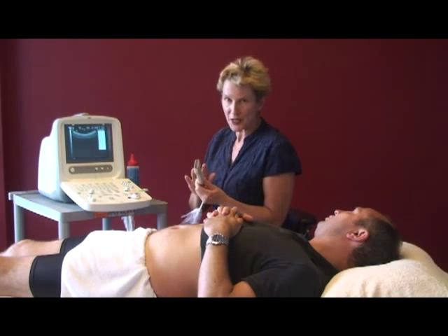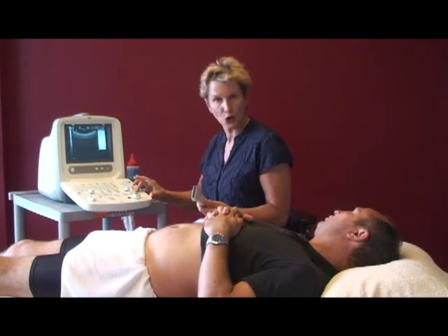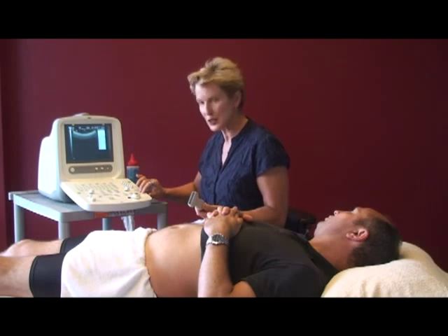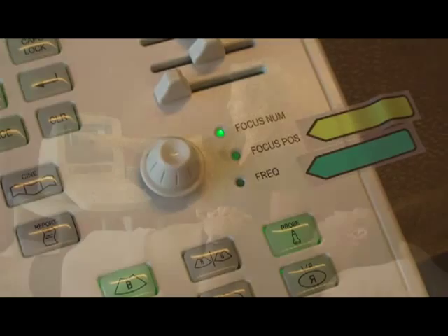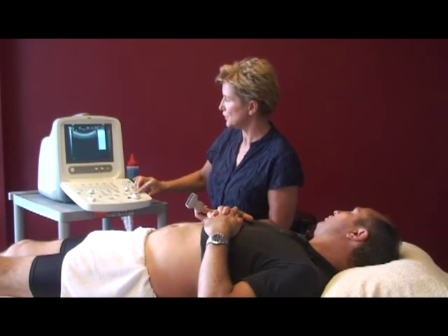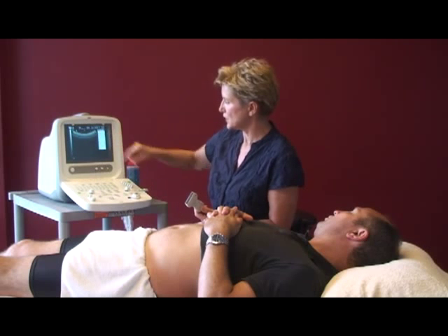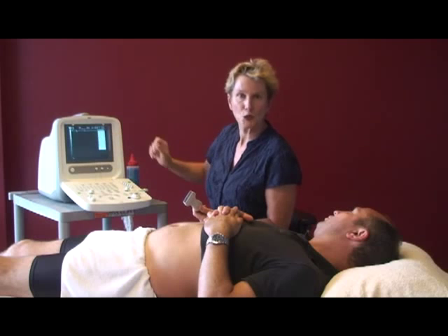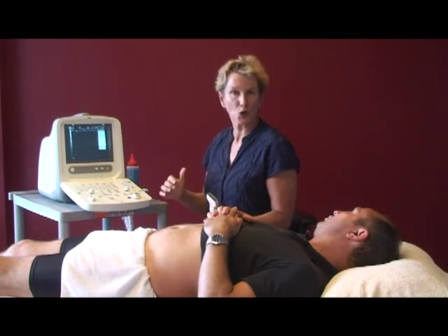Now, if you're going to switch from one transducer to the other, you will need to change that on your machine. So if you have a look, you'll find on your machine it indicates probe. And here you can see, if you come to the screen again, I've got the linear transducer here. Sorry, the curved transducer, so we'll go back there, the curved. And if I change that, I'm now on the linear. So be aware of which transducer you've chosen and what you're going to look at.